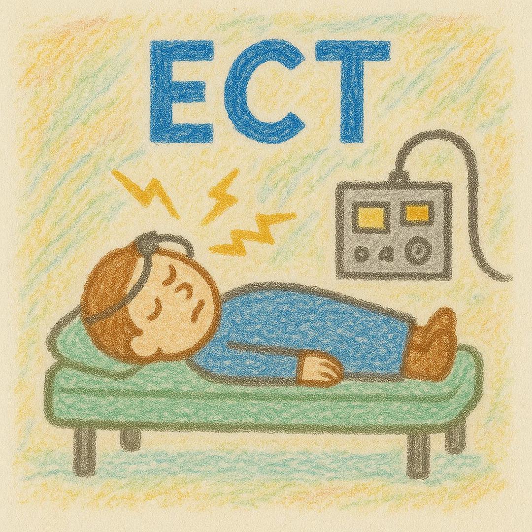There's another placement called bifrontal, where we put the two stimulus electrodes 5 centimeters above the outer canthus of each eye. So just right on the frontal part of the brain there. And again, we're trying to avoid the hippocampal structures, primarily those memory structures, temporal lobes. And that placement also seems to be associated with fewer cognitive side effects. But the studies on this are limited, so it's not clear how the efficacy compares to the other two.